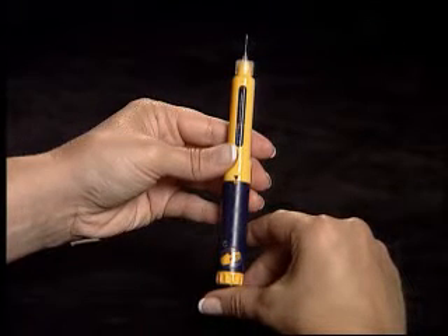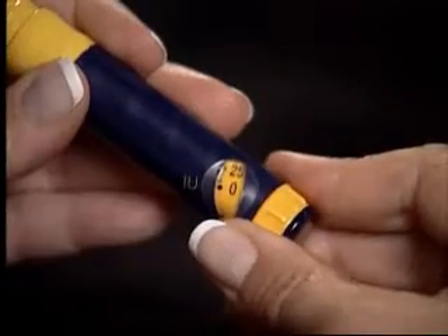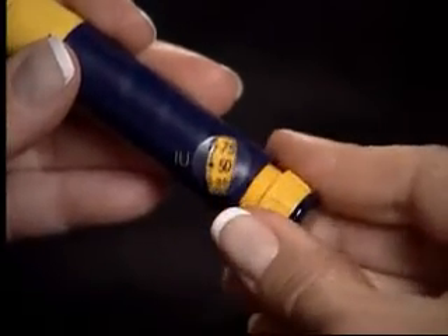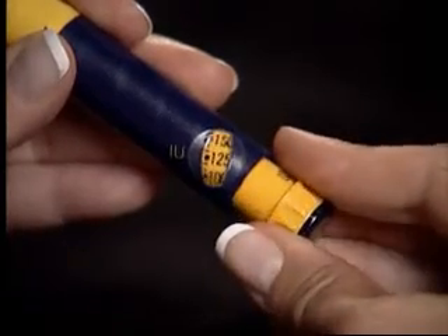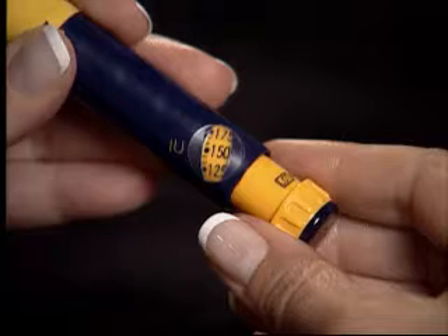Repeat this process until a droplet is seen. Turn the dosage knob to your prescribed dose. For demonstration purposes only, we will be using 150 international units.